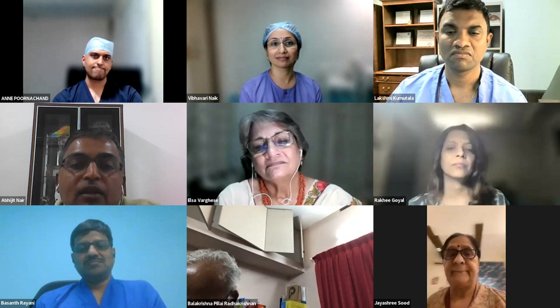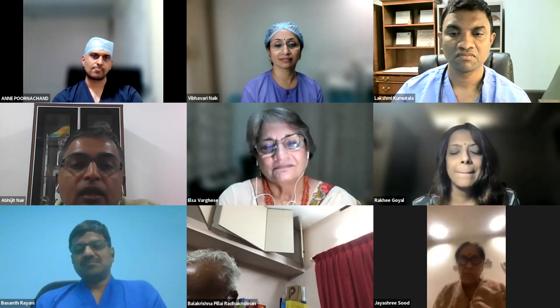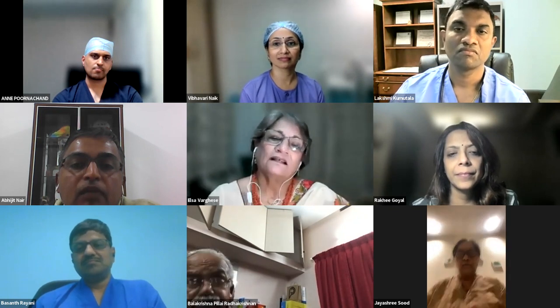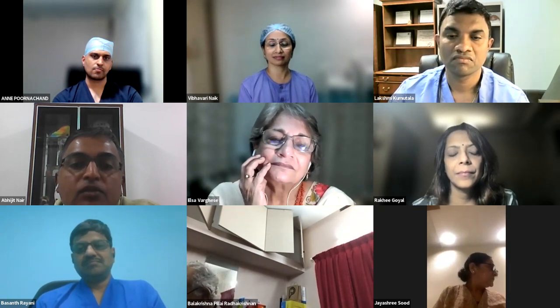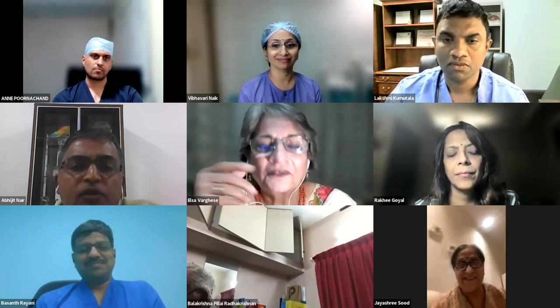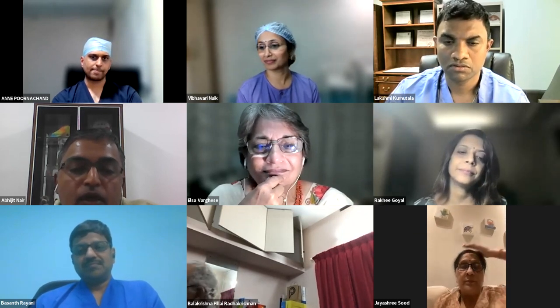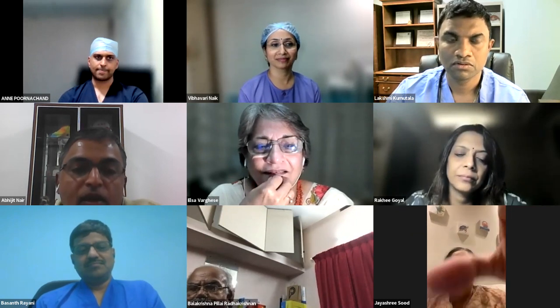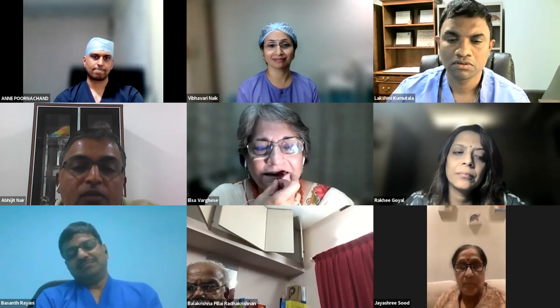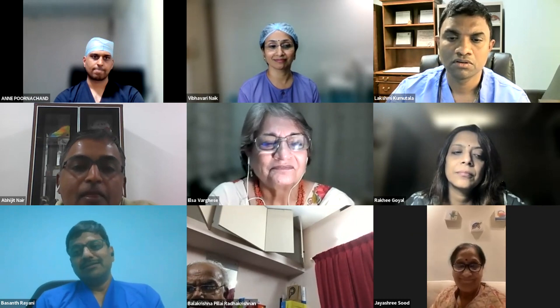Whatever said and done, keeping a machine trigger free is very difficult. But one thing that can be done is, in such cases, if you use an ICU ventilator, that will probably totally prevent any kind of catastrophe. Yeah, and probably we also have to change the soda lime. Of course, soda lime has to be changed, the circuits have to be removed, and you have to keep the flows on. Theoretically it will clear, but still you never know, because the trigger can be a very small trigger in certain patients. So the transfer ventilators that we use could be a good option.